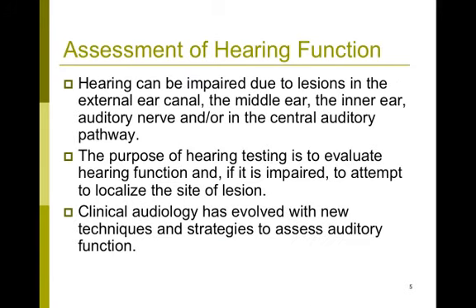But again, for the majority of an audiologist's time, you would be assessing hearing. And hearing can be impaired due to lesions in the external ear, the middle ear, or the inner ear, or anywhere above the inner ear before it reaches the brain. The main goal of your hearing assessment would be to evaluate whether the hearing is within normal limits, and if it is impaired, we would want to quantify how much hearing loss and try to localize where this hearing loss is coming from, or where the damage is in the auditory system.